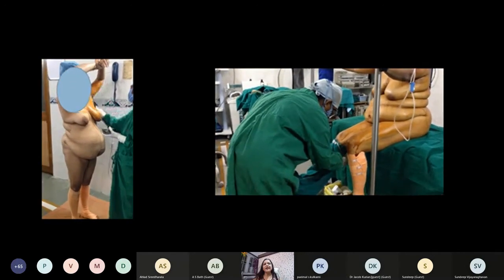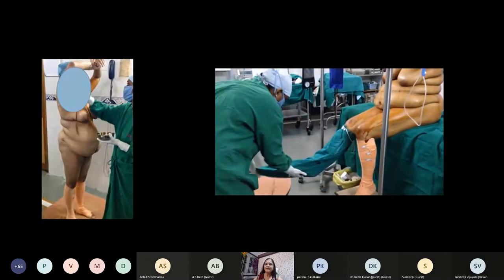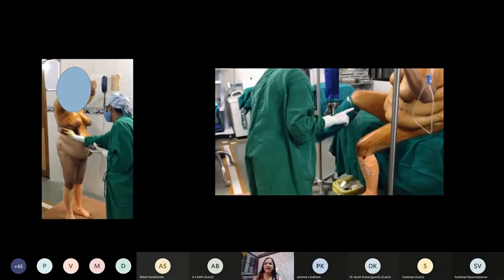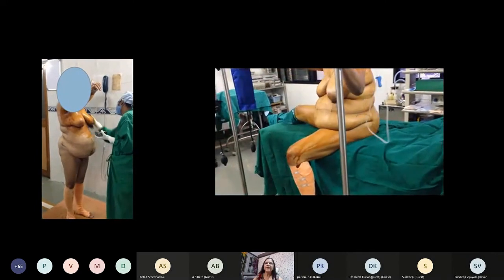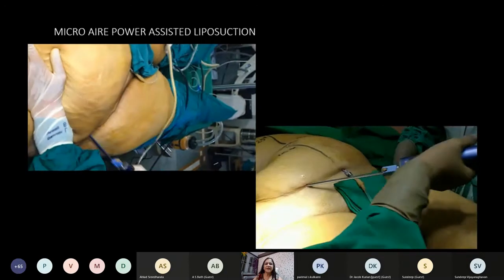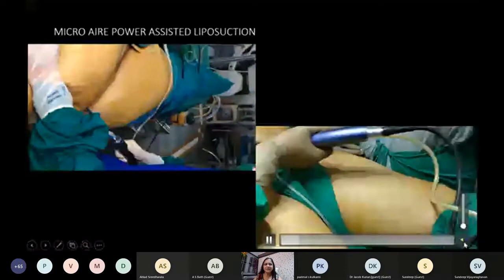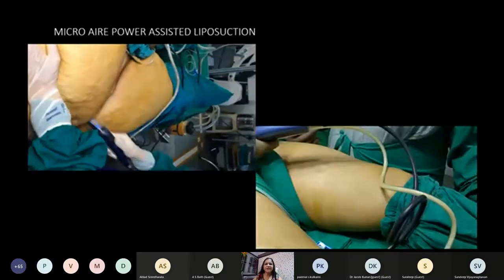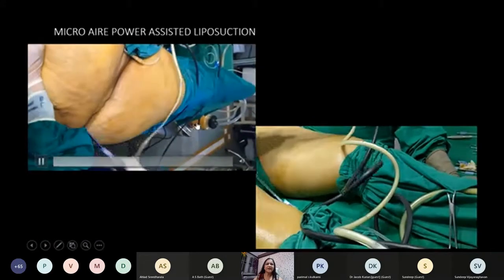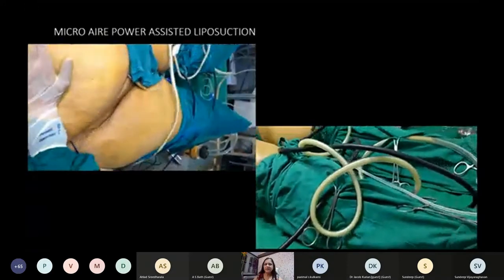We drape the table completely in sterile drapes. The doctor puts leggings on, and then the anesthetist washes up completely and gives spinal and epidural anesthesia. This is the Microaire power-assisted liposuction — do listen to the noise. It is very safe and effective. You can see a very nice and clear aspirate without much blood.